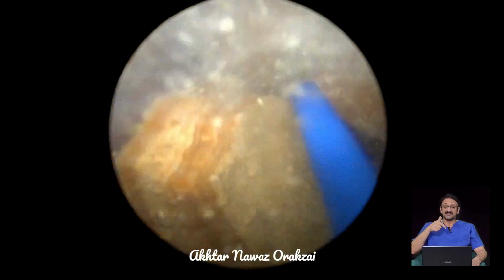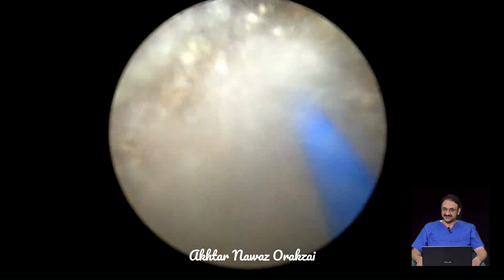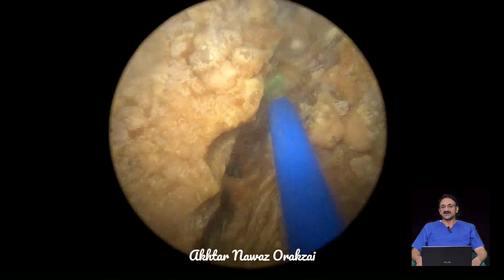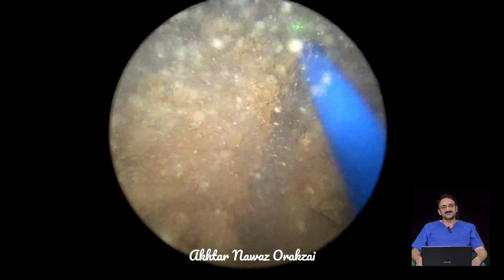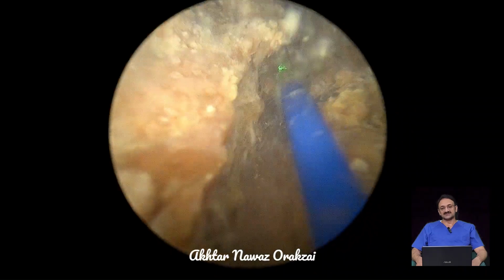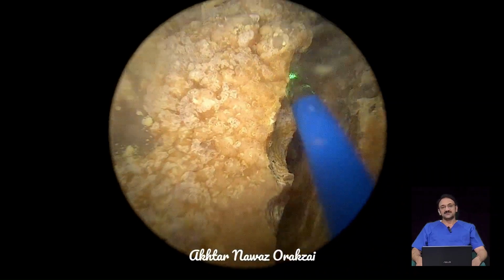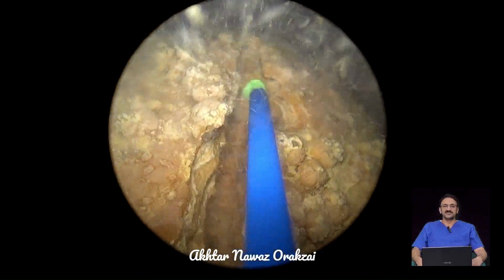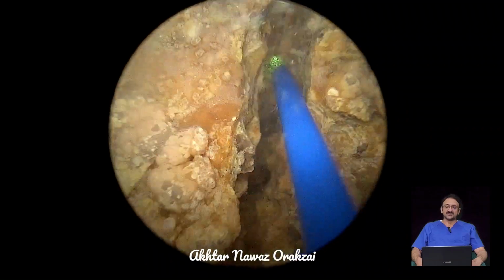So that is the standard, but in this case the patient was of a younger age and sexually active as well, and wanted to preserve his sexual function. That's why we counseled him, and upon his agreement we decided that we will perform the litholapexy and removal of the stone, and then he will be on alpha blockers for a while. If he feels, or we feel, that the prostate is still occluding, he has a large post void, or if he goes into retention again, then we may perform transurethral resection. So the chances of post-operative infection will be really small.